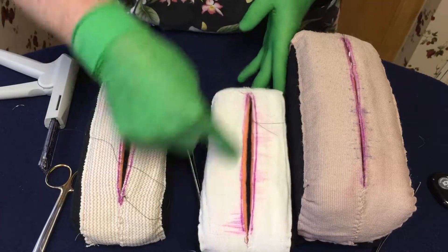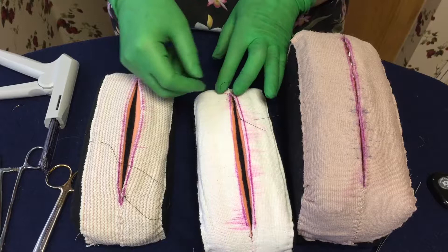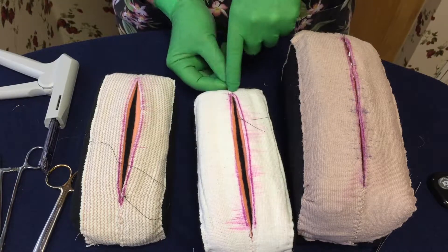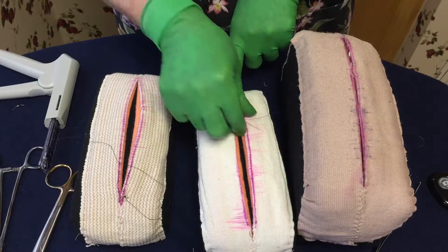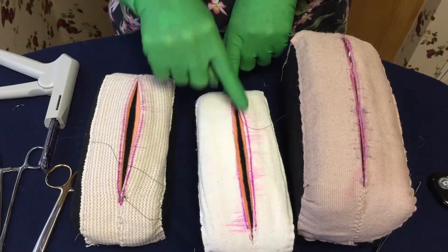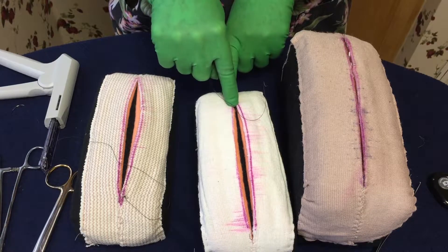When you come down to this side — say I'd suture it all the way down there — coming into this side, I would do the same thing if I was doing uninterrupted. I would keep my loop on this side in the corner, and I would put my knot to that side, medial. So loop in the corner, and the knot medial.